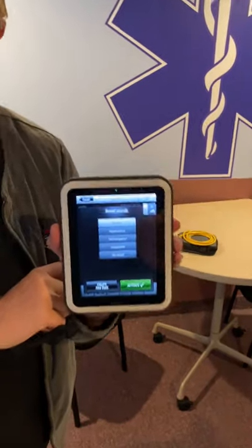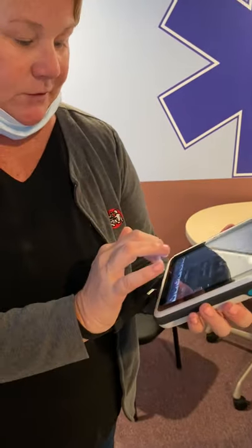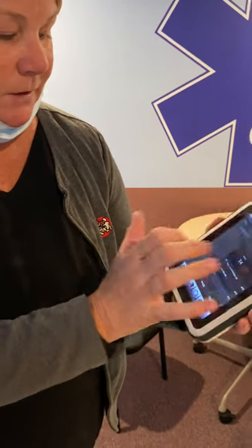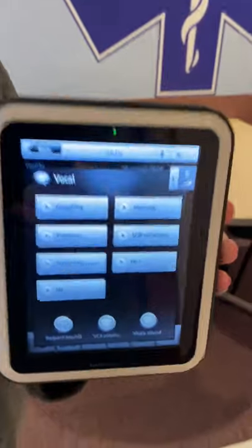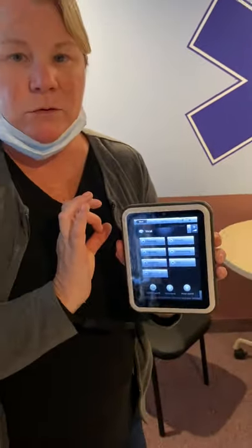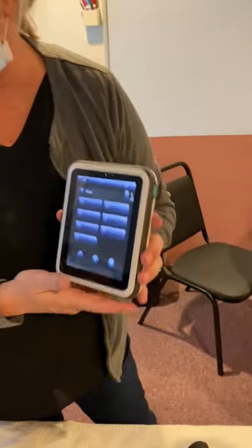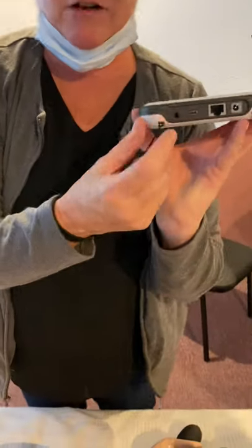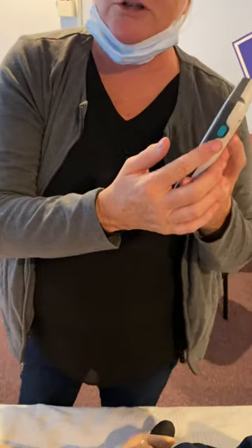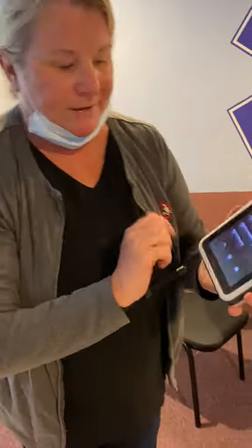He does have bowel sounds. You can go through and change the parameters on the bowel sound, change the volume, and hit Activate — just as with all other parameters. I'm going to take him off Stridor. Under Vocal Sounds, you do have a headset — it's a standard headset that plugs in at the bottom with a push-to-talk button. If you plug that headset in and push to talk, the vocals will come through the mannequin's microphone in his mouth.